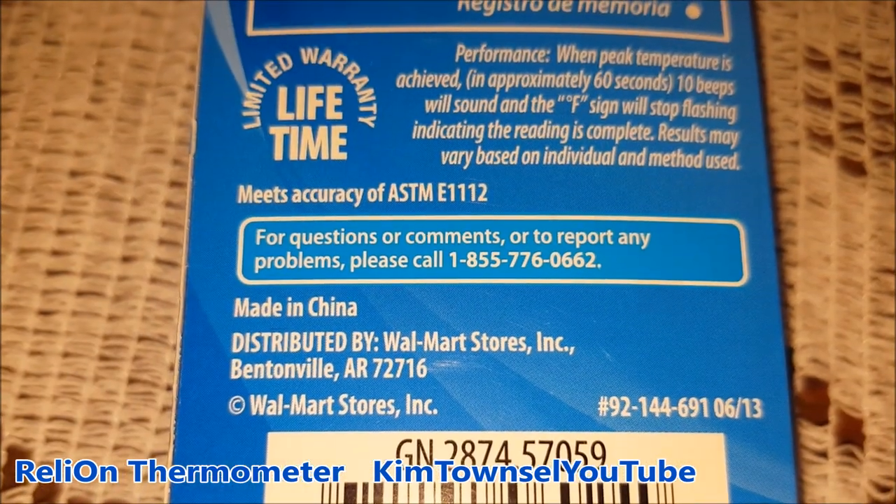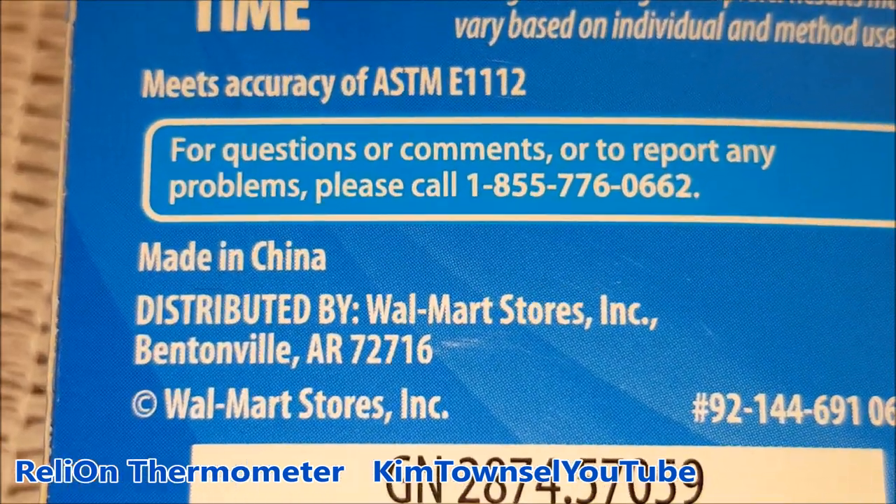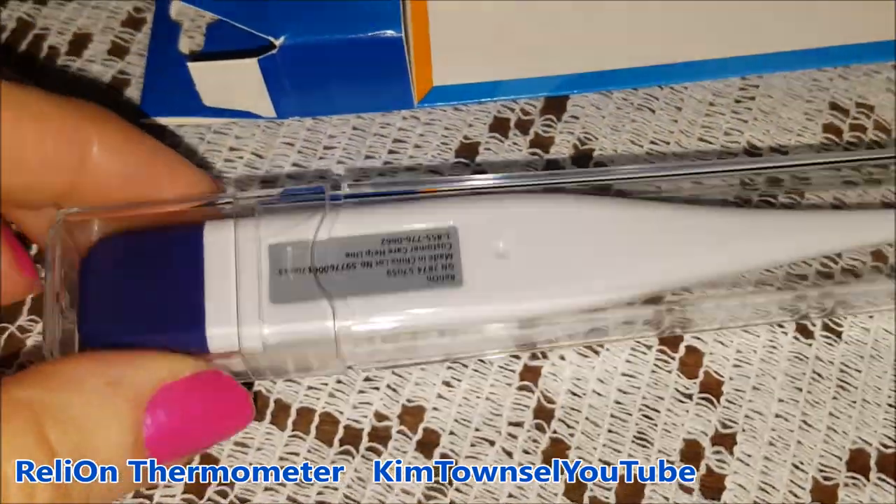And made in China — big surprise. There's a phone number for information if you want it. It does come in a plastic case, which is nice.